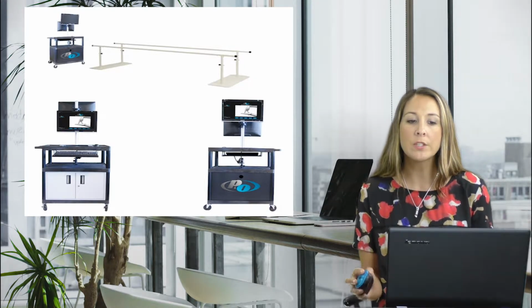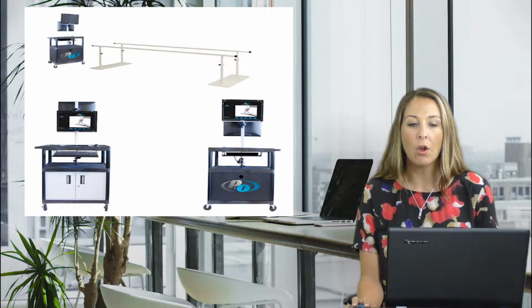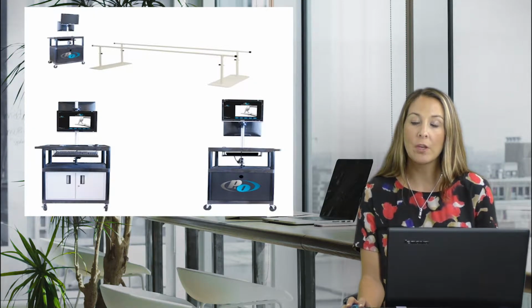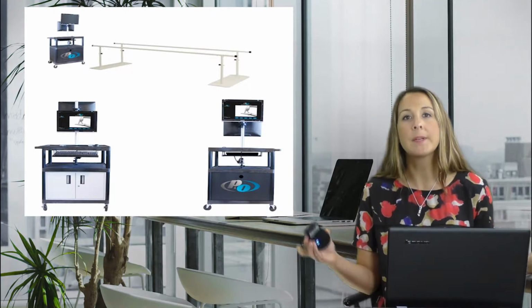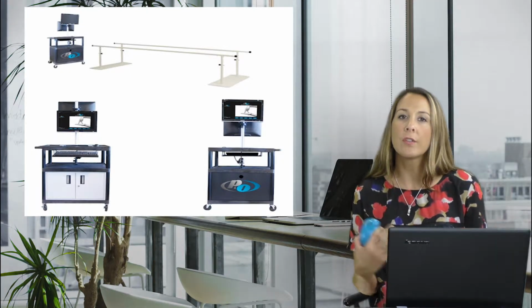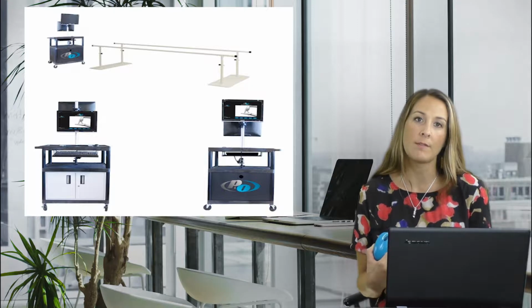So what you're going to do is install the video cameras that would take the patient video from the coronal plane, and then you'd have another video that would take the sagittal plane. And it's going to simultaneously stream those into the software so that they're already synced for you when you want to review your videos.